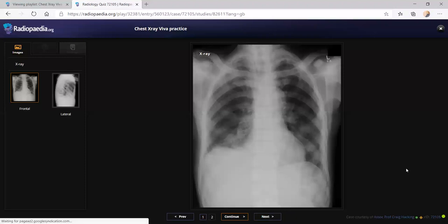So this is a 70-year-old male coming with some lethargy. So 70-year-old male with lethargy, frontal chest radiograph. The striking finding I can identify is in the right paracardiac region. There is ill-defined opacity. Yeah, that's a, disregard that. That is vascular shadow. All right. So, I'm looking for, and the other thing I can see, there is an increased translucency of left hemithorax.